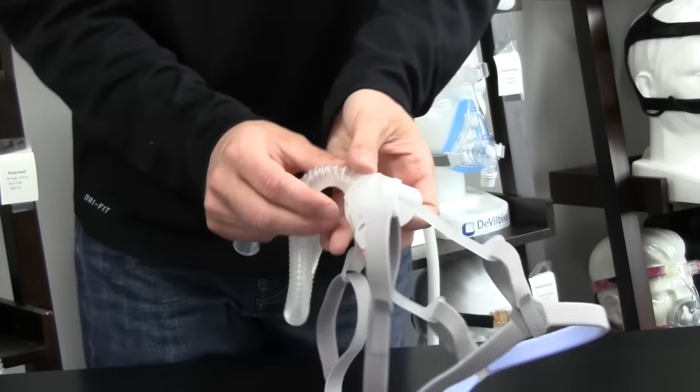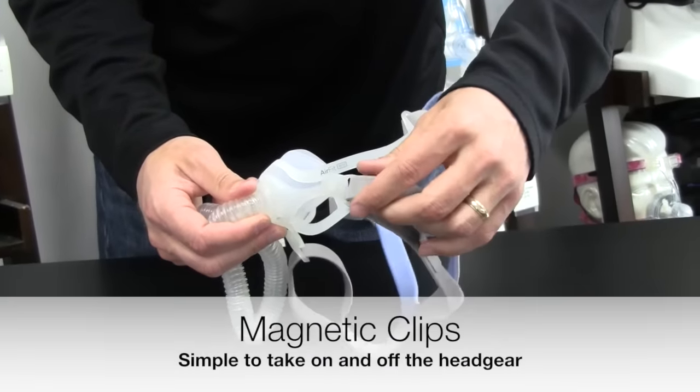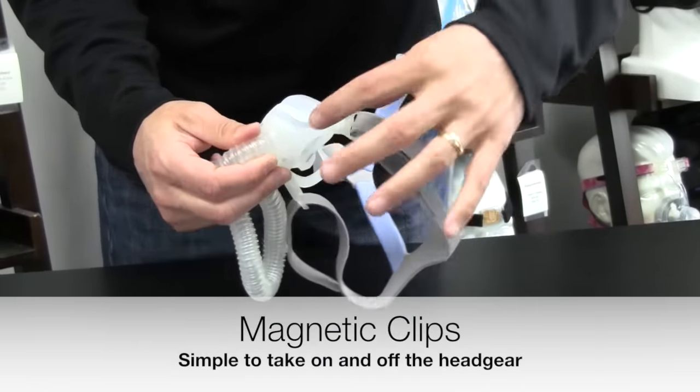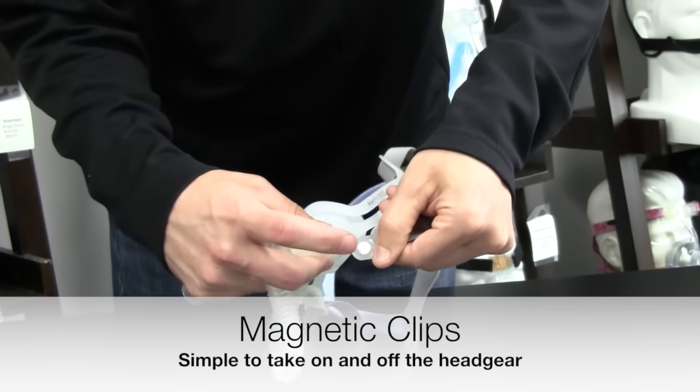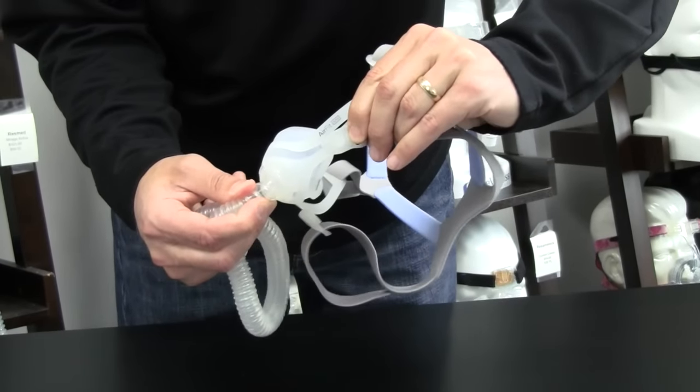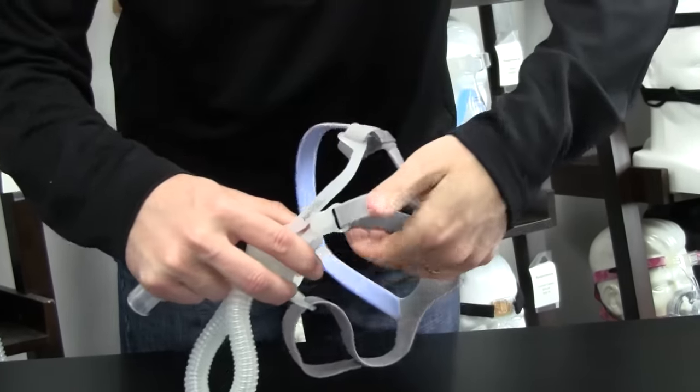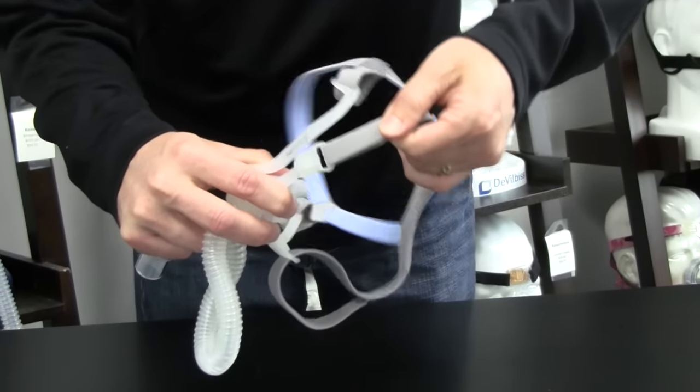Another unique feature with this mask is they use these magnets to hold the bottom two strap headgears into place. There's no clips anymore. There's actually a lip on here. The magnet is set back in, so it fits great. And it's really hard to pull it out. If you pull it out this way, it's easy. But how the mask is going to sit on your face, that's not moving.